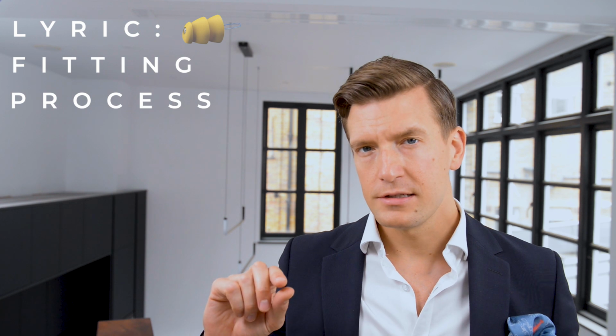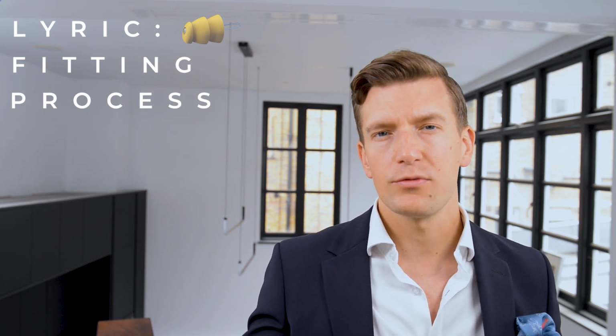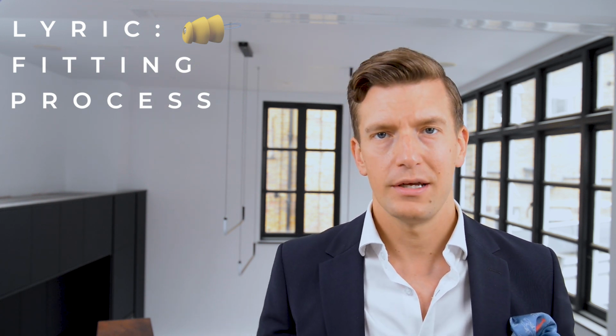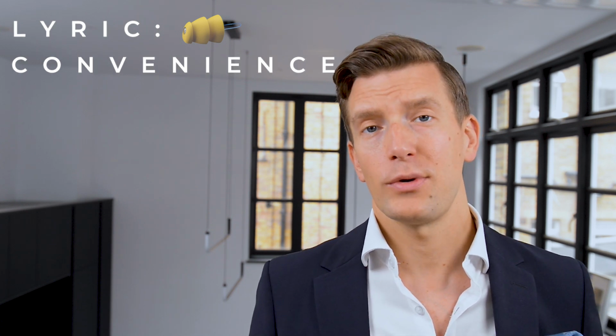When the Lyric is inserted to the optimal position, the user would experience a small amount of pressure because of where it's resting on the ear canal wall. As soon as that's released, that pressure should disappear. It's a normal experience. Although it's water resistant and has protective layers against moisture, it's still an electronic device at the end of the day with exposed microphones.